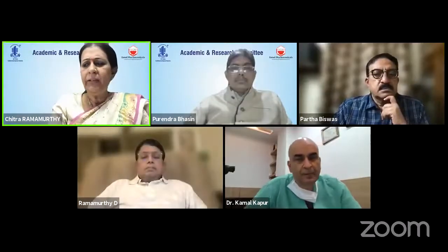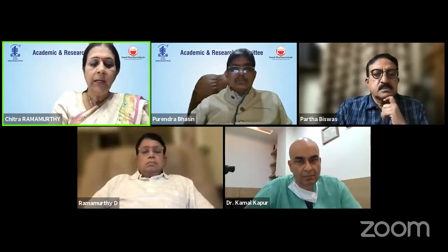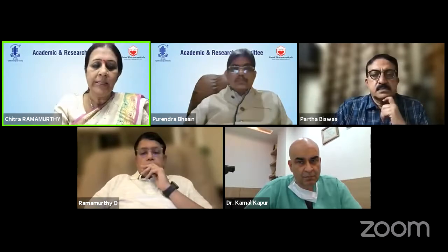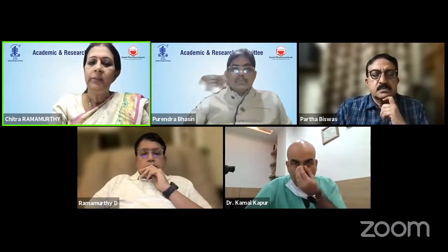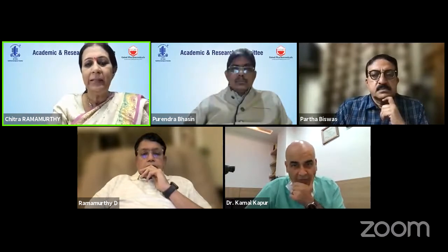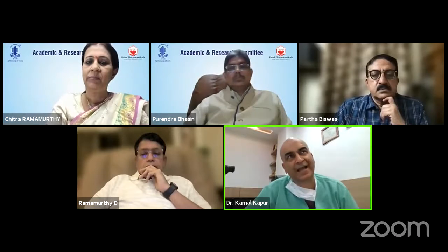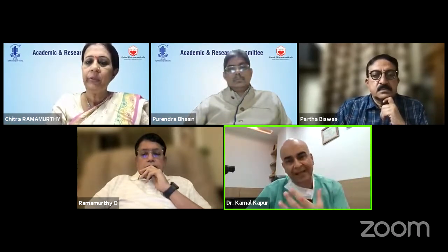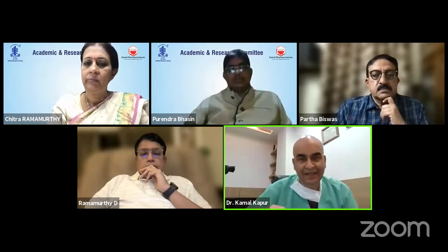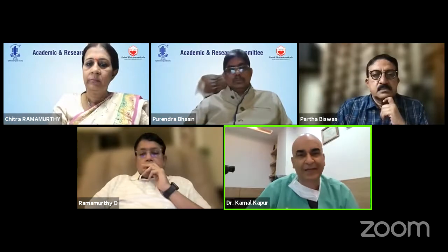Now, this is something we might transgress if at all, but I don't think we should. AC depth of 2.7 millimeters, would you suggest a phakic IOL? Okay, now I think 2.8 also is not the actual cutoff. What matters is the lens rise that I have, the angles that I have, and if I'm operating on a hypermetrope, then even 2.8 is not my cutoff.